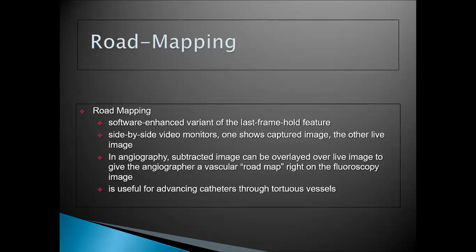Then we have road mapping. Of course, it's a kind of last frame hold feature. How is it? Right from the name, road mapping. In this road mapping, we have two monitors side by side.